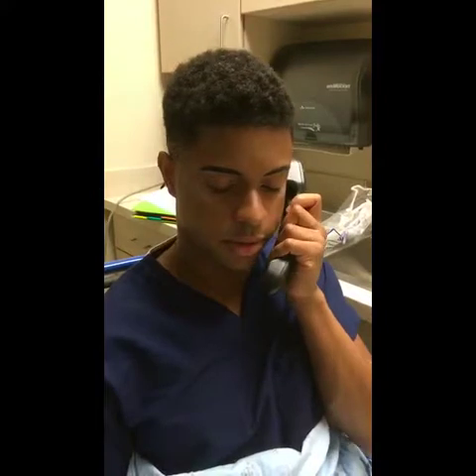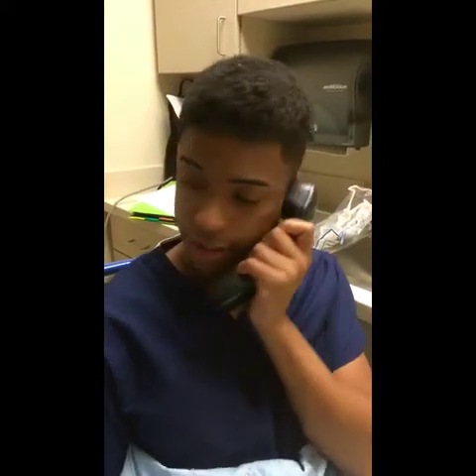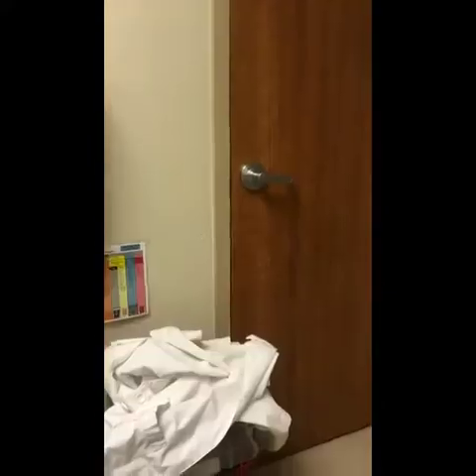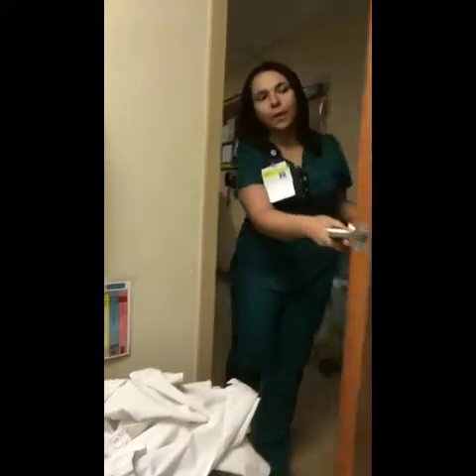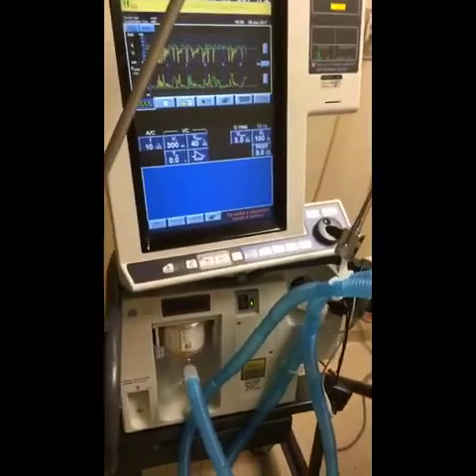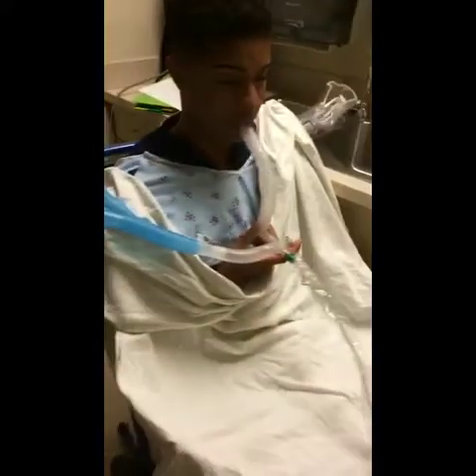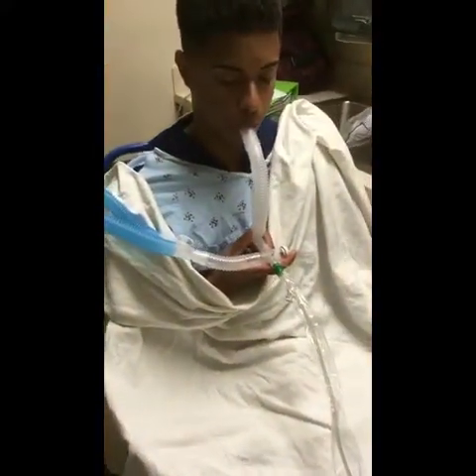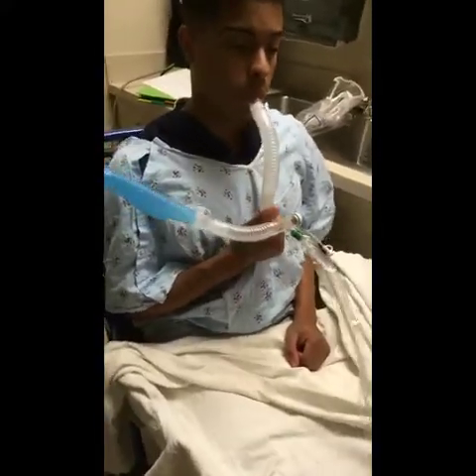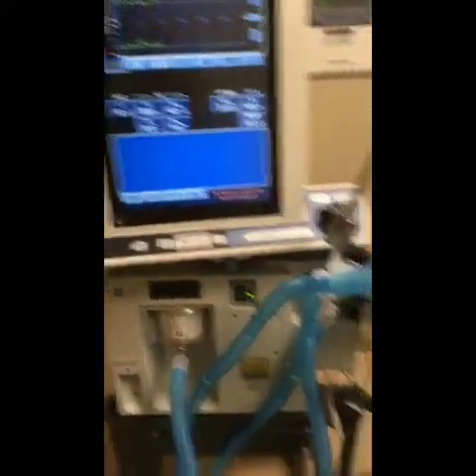Excuse me, will you come to room 333? The patient's ventilator will not stop alarming. Sure, no problem. I'll be right there. So what's going on? The ventilator won't stop alarming. Okay, well, let's take a look. Oh, wow. It seems like the patient's coughing a lot. We can try to suction him. I suctioned him twice and I didn't get anything out. Oh, okay. I don't know. He doesn't look real sedated. Maybe we could go up on his Diprovan.